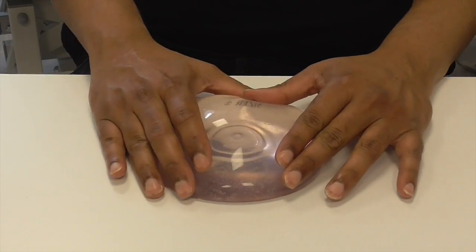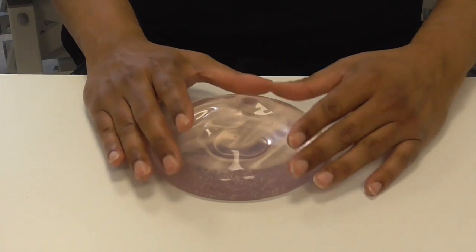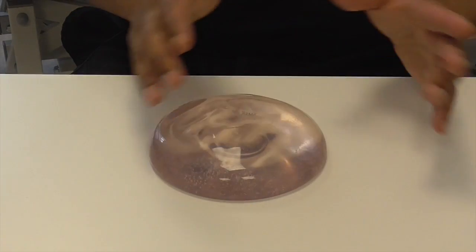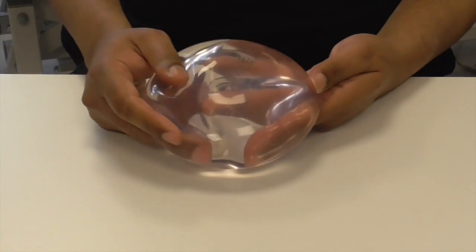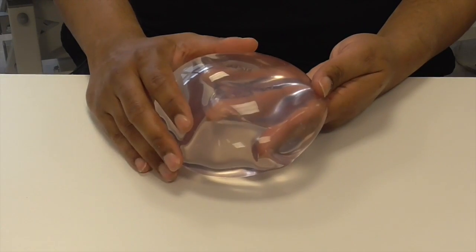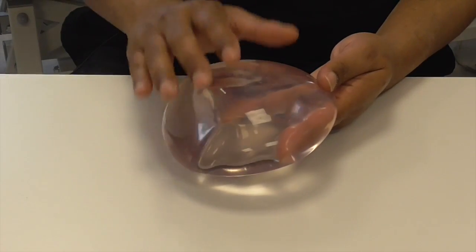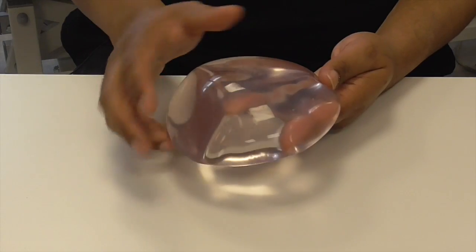Now all silicone implants that we use in the UK are essentially a silicone shell with silicone gel inside, but there are varieties. This one we have is a smooth shell implant, meaning the surface is nice and smooth, and intuitively you think this is the best thing.